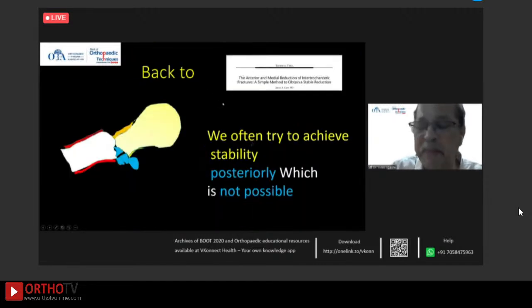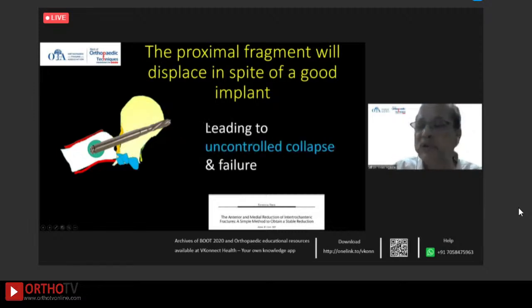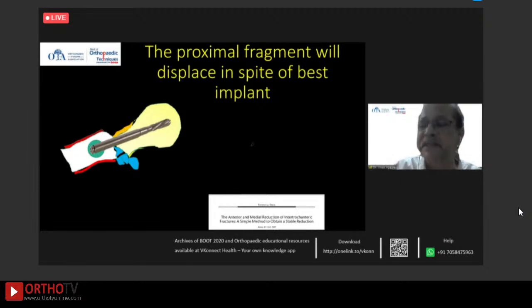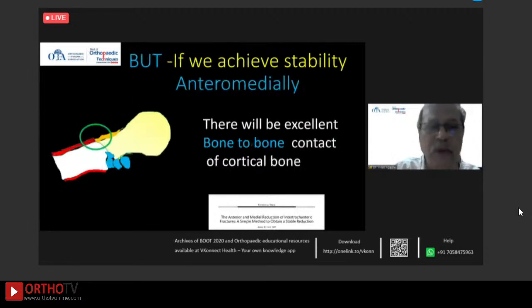Coming back to Carr's paper, what he suggests is we often try to achieve stability posteriorly, which is not possible. And if you fix the fracture like this, the proximal fragment will displace in spite of a good implant, because there would be an uncontrolled collapse. There would be no bony stability achieved, and the proximal fragment will continue to collapse and will lead to failure.